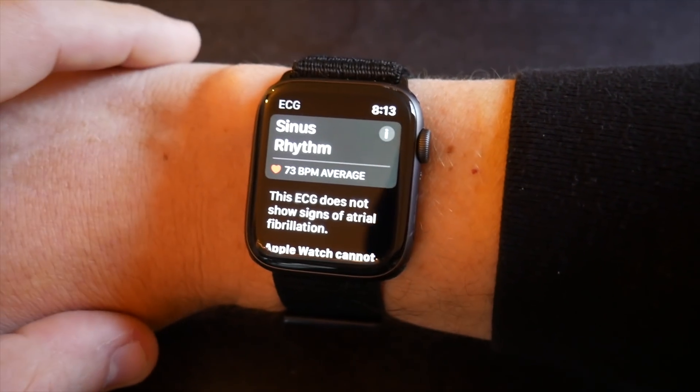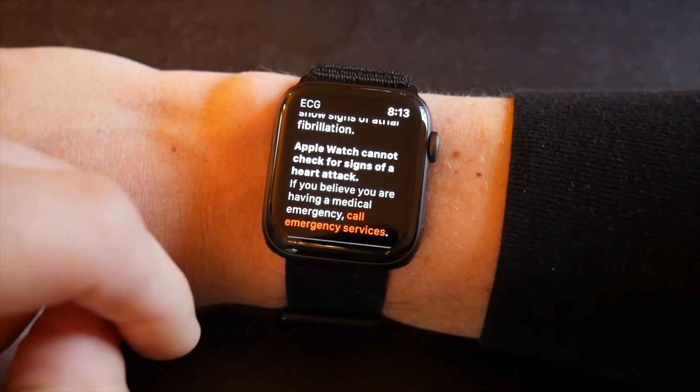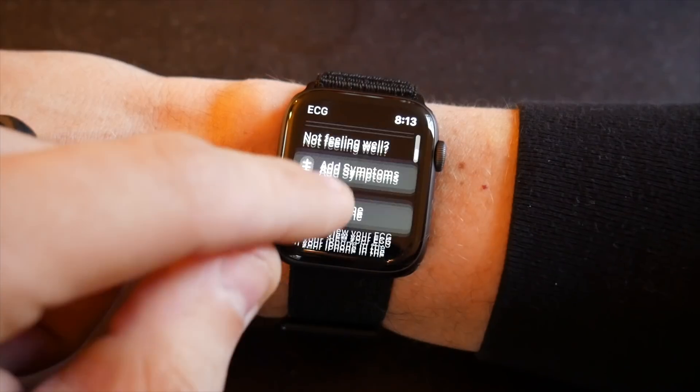The test results you just saw were taken under normal conditions — first thing in the morning I got up and just took the test. Going forward, I want to run some tests to see how the ECG sensor performs after intense exercise or after consuming a lot of caffeine, to see if I get any different readings or alerts based on those activities.